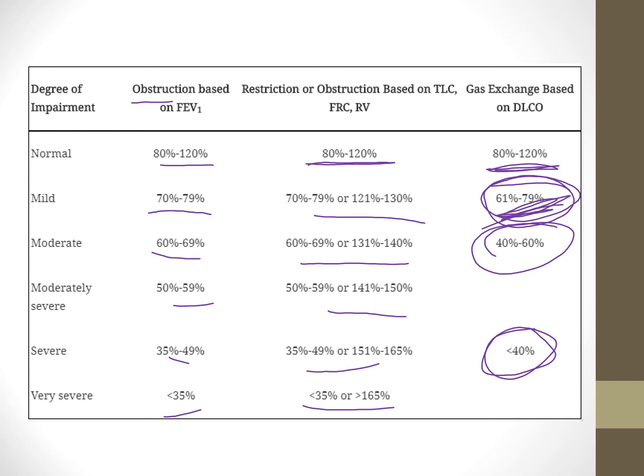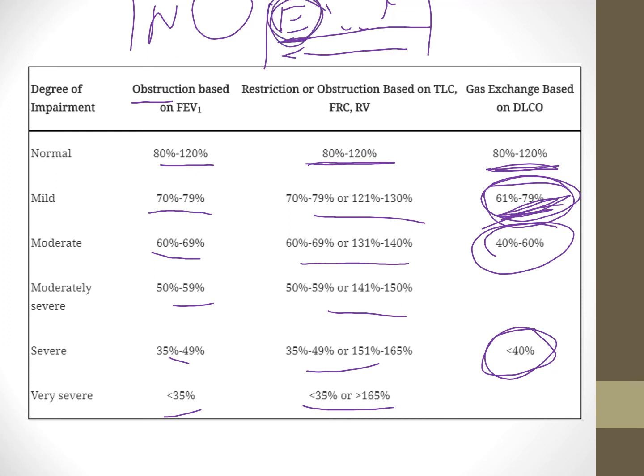So there are two primary things that can cause the DLCO to go down. Either something like emphysema, where, remember, a normal alveolus, and then in emphysema we have that destroyed alveolus and the capillaries destroyed too. So with emphysema, you would have an obstructive pulmonary function test with a low DLCO, and then you know it's emphysema. So if you have a low DLCO and the PFT shows obstructive, you know it's emphysema.